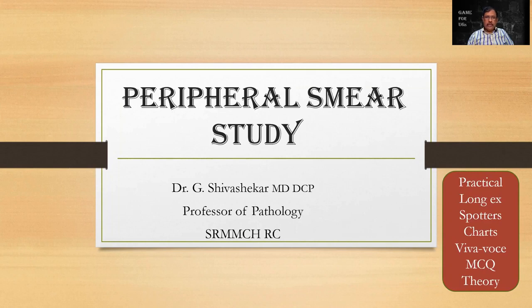Dear students, I now take you to another long exercise, the peripheral smear study. Be informed that our experience with the peripheral smear study is hardly sufficient. In fact, you will start learning this after you complete your post-graduation. Anyway, the importance of it is given in the enclosure. It is a long exercise.